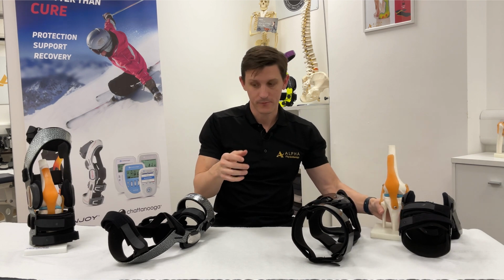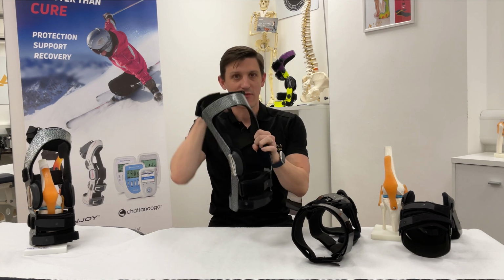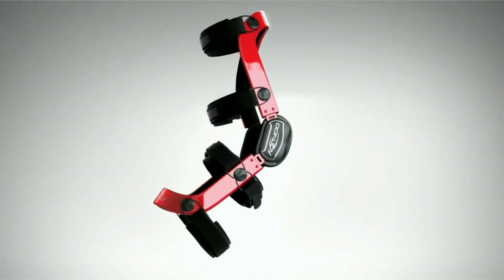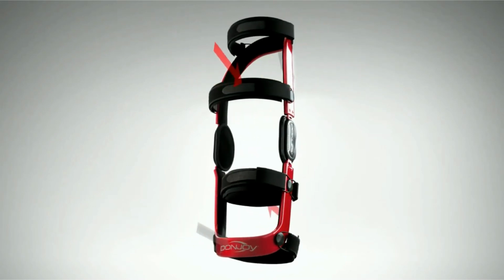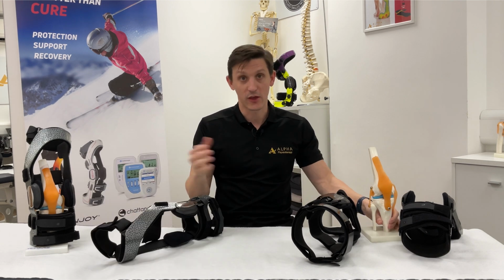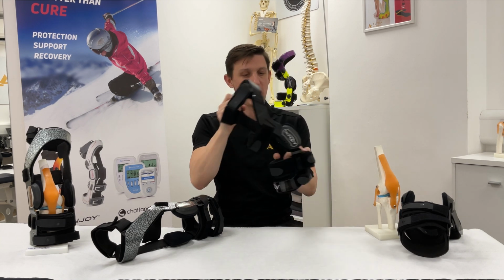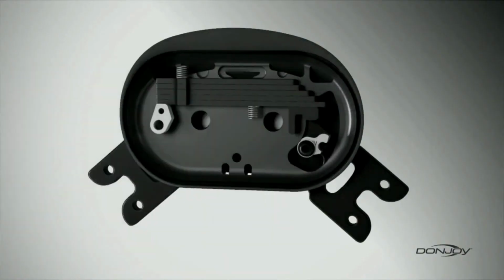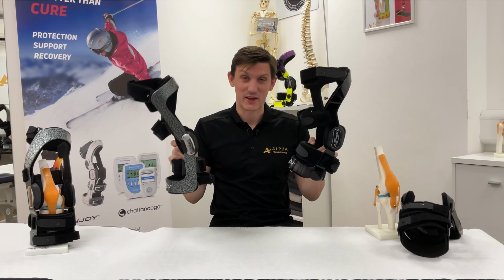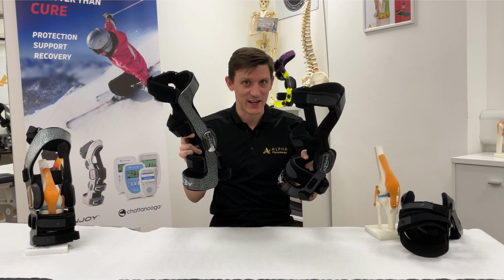In particular, the Donjoy braces have a very effective 4-point leverage system, whereby we have a thigh strap, a tibia strap, and supportive strapping around the knee that helps to reduce this anterior tibial translation. So it's an effective supporting device to help prevent that translation. Another way of injuring that ACL is often with a hyperextension, and these braces have a fantastic hinge on them called a force point hinge, which means that as you go into extension there is a huge amount of resistance at that point. So both of these braces can be very effective at reducing both that load onto the anterior cruciate ligament, but also at preventing that knee hyperextension.